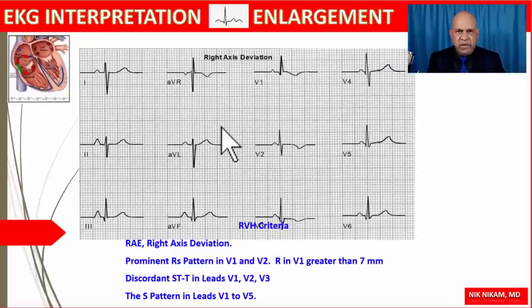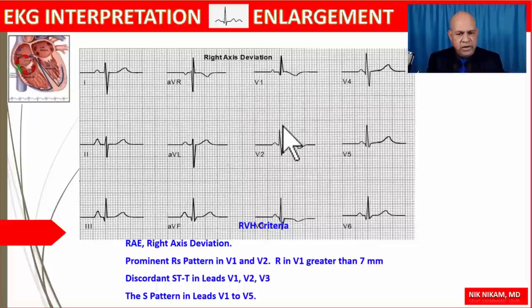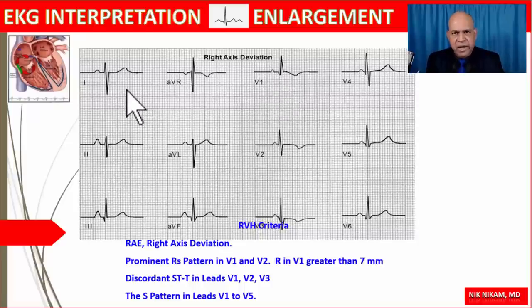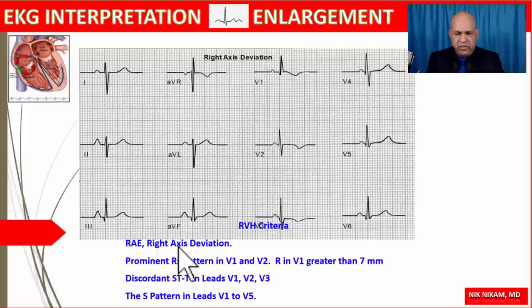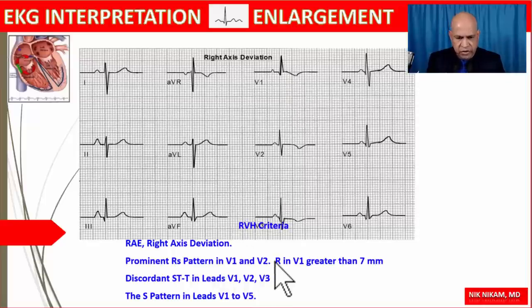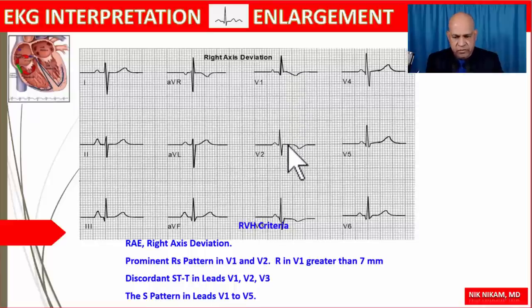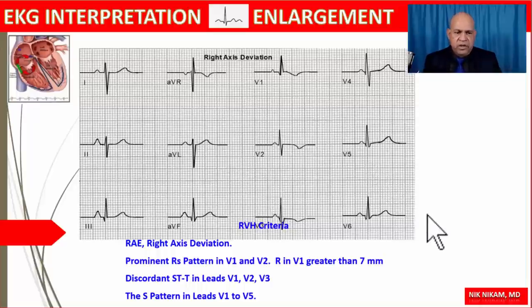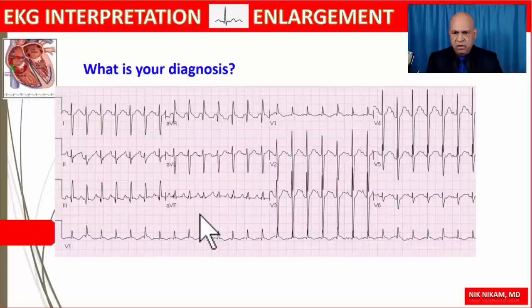Looking again at this tracing: right axis deviation, right atrial enlargement, and tall R waves in the anterior leads. The features indicating right ventricular hypertrophy include right atrial enlargement, right axis deviation, an R:S pattern in V1 and V2, R in V1 greater than seven millimeters, and discordant STT changes. We may also see deep S waves in the lateral chest leads on other tracings.